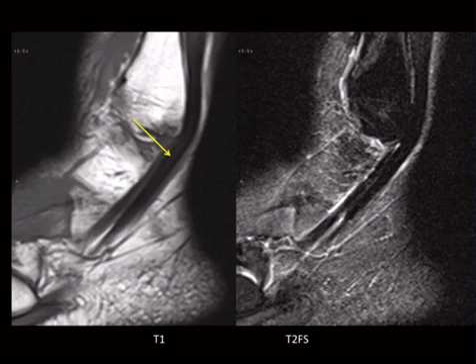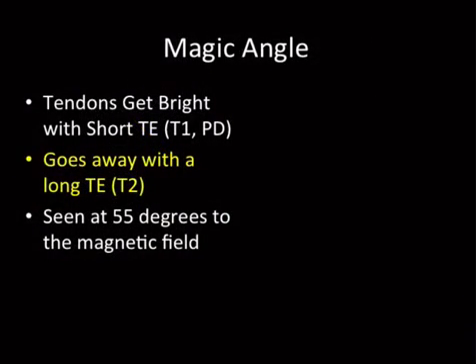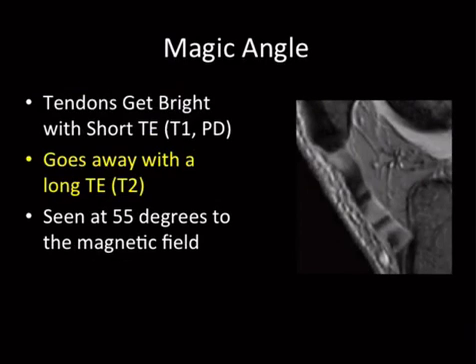It's actually better at a higher field strength because there's greater shortening of T2 relaxation times. So if you wanted to make it better, you could stick them in a bigger magnet, a more powerful magnet. But the real practical pearl is that you just check your T2 to see if it's real or not.